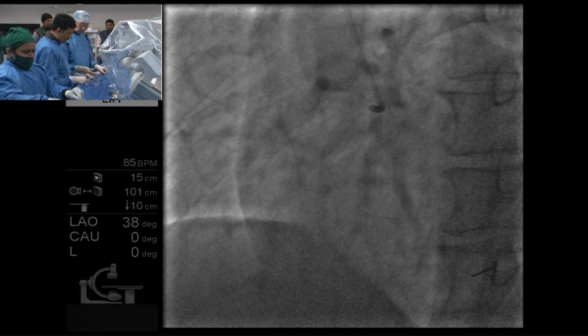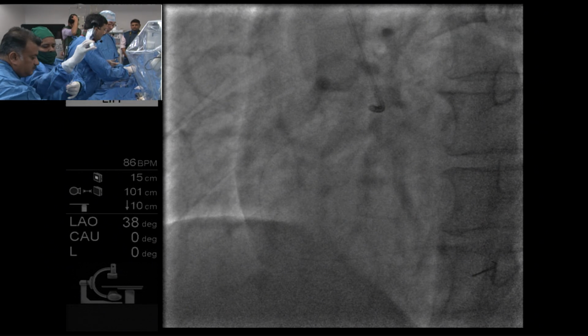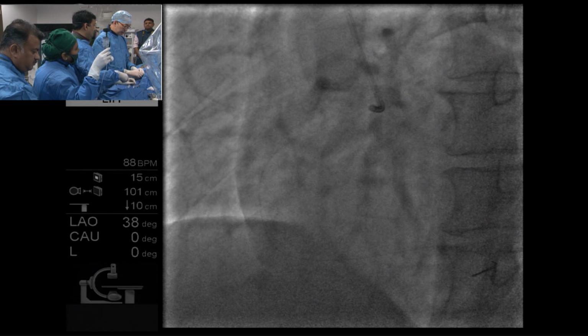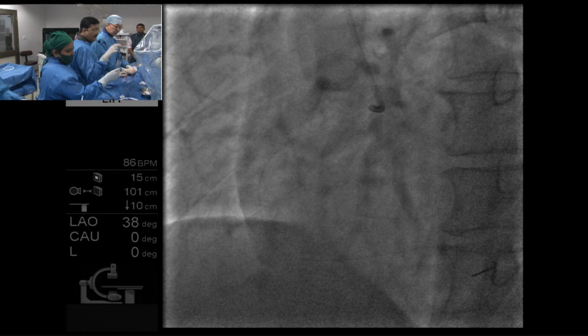Is this a case for a spot stenting or a normal-to-normal covering? It looks like the whole length of the RCA is diseased. Yeah, I think full length disease. I think maybe two stents. Yeah. That will be ideal.